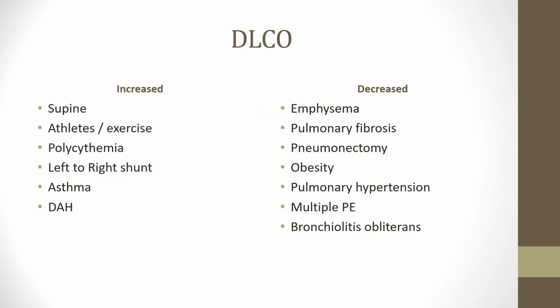So things that will cause the DLCO to change: if the patient position, if they're laying supine, it will actually be an increase because of the VQ match. Athletes, absolutely. If they have a lot of red blood cells, left to right shunt going on, so that's a good blood to bad blood side. So it's the left side, right, the oxygenated blood going over to the right side.